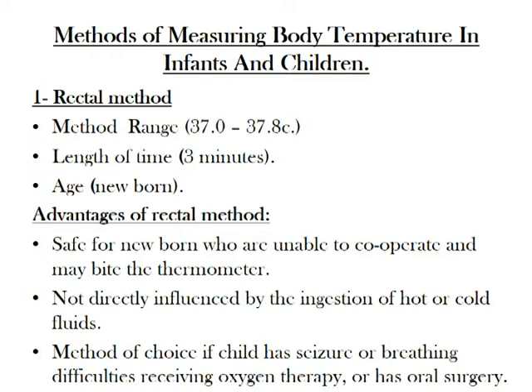Safe for newborns who are unable to cooperate and may bite the thermometer, and not directly influenced by the ingestion of hot or cold fluids. Method of choice if a child has seizures or breathing difficulties, is receiving oxygen therapy, or has had oral surgery.